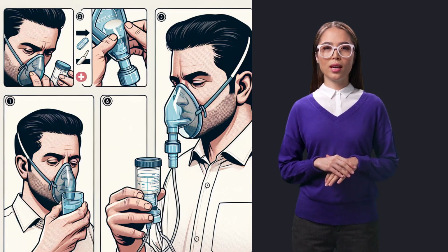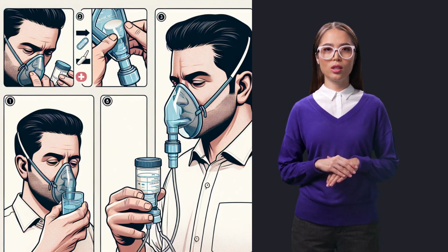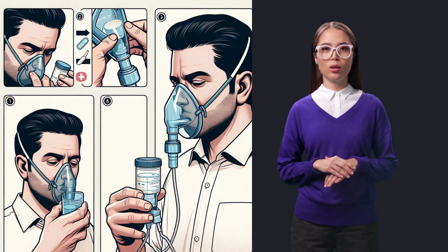How to assemble the nebulizer. Once the medication is ready, it's time to assemble the nebulizer. Connect the tubing to the compressor and the medication cup. Attach the mask or mouthpiece to the medication cup. Double-check all connections to ensure they are secure.